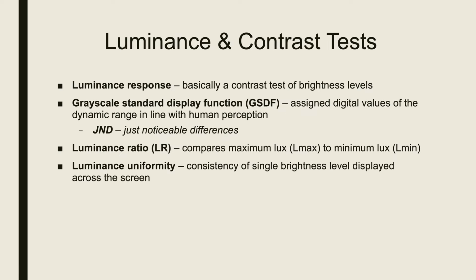A luminance response is basically a contrast test of brightness levels. The other thing they're measuring in the monitor is the grayscale standard display function. This is assigned digital values of the dynamic range that are in line with human perception. So what they're looking at in the grayscale is the just noticeable differences in the levels of gray.